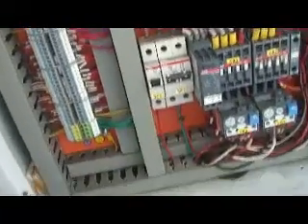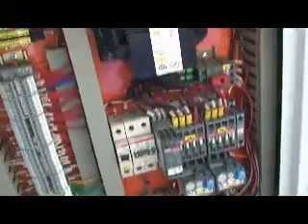So make sure, visual lookout, make sure everything looks like it's in good condition. You can check your wiring in the condenser also to make sure there's no wires that are touching the hot pipe and being burned or fraying or dry rotting. So everything looks okay on this machine.